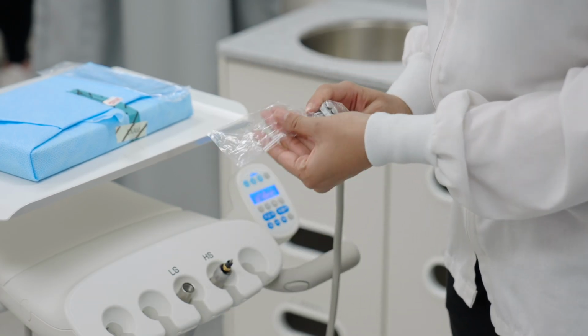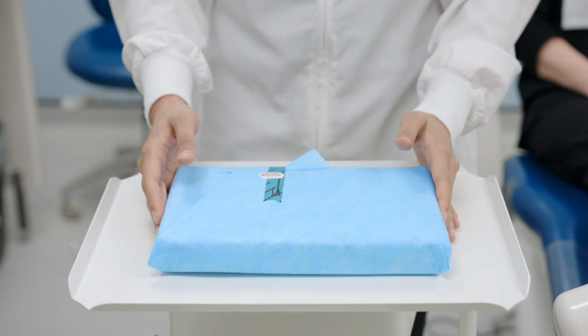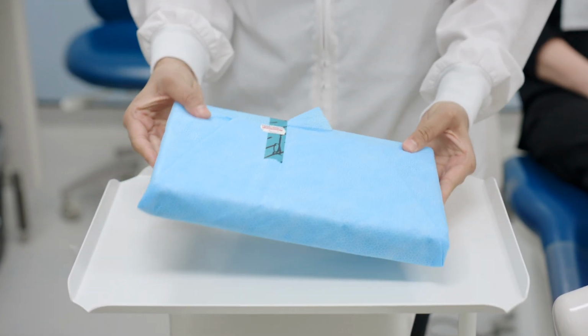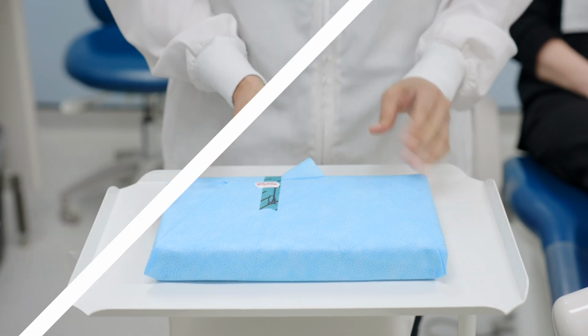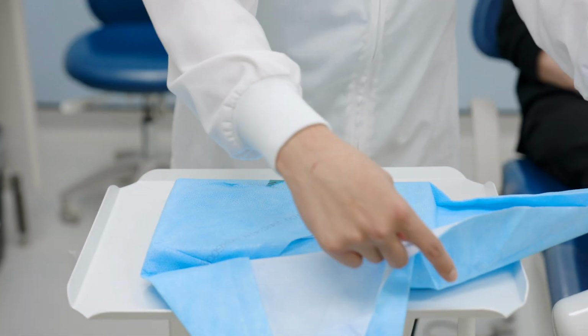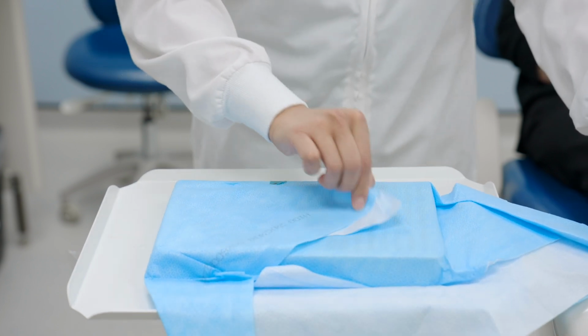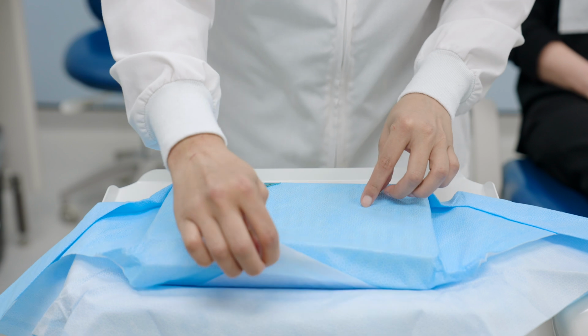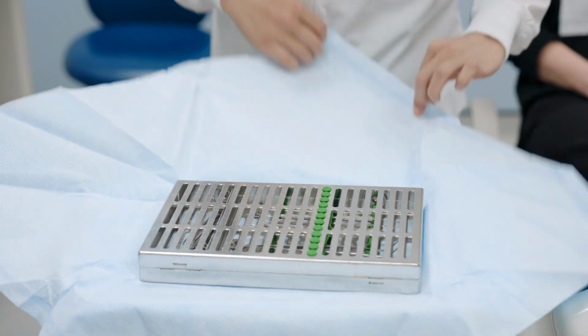Once the patient is seated, inspect the exam tray for any rips, tears, moisture, or debris. If the package is compromised, get another tray. Next, unwrap the exam tray. Pull the tabs of the blue sterilization wrap to expose the exam tray. The sterilized blue wrap acts as a sterile barrier on the table.